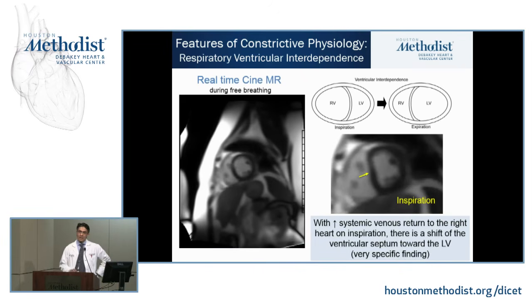Furthermore, even better than that is what we have. We have a real-time sequence where we can actually watch the left and right ventricles simultaneously as they fill and expel blood. And what I hope you'll see here, this is this patient free breathing. And I hope what you'll see is as this diaphragm drops, the patient has inspired.